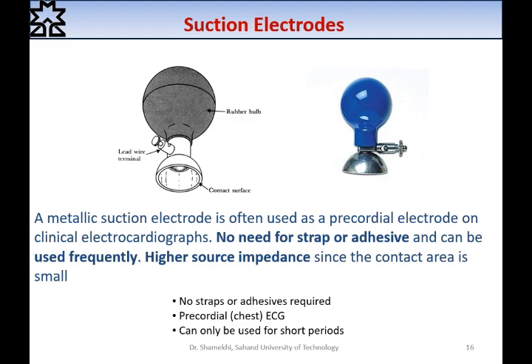Suction electrodes are the other electrodes we will consider in this lecture. This electrode is a common electrode for recording precordial or chest ECG.